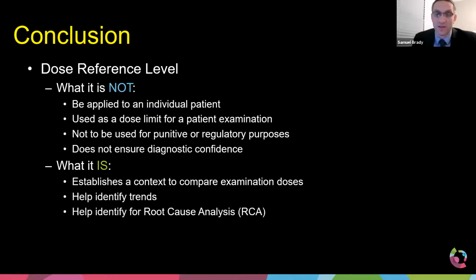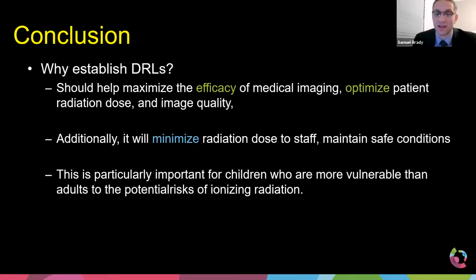And then it allowed us to do what's called a root cause analysis. Why are our brain doses high? How can we improve those? And we want to make sure, if the dose is too low, is it appropriate? Or if it's too high, why is it high? Sometimes it's required to be high, and sometimes it's okay to be low. But we need to make that determination.